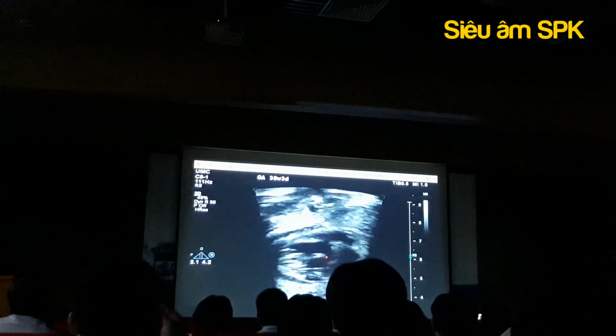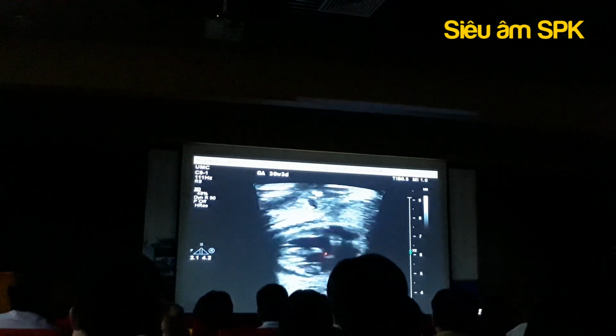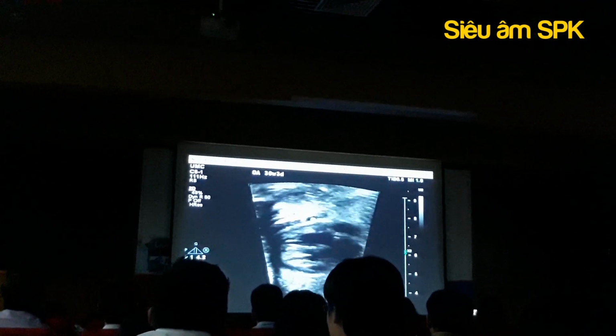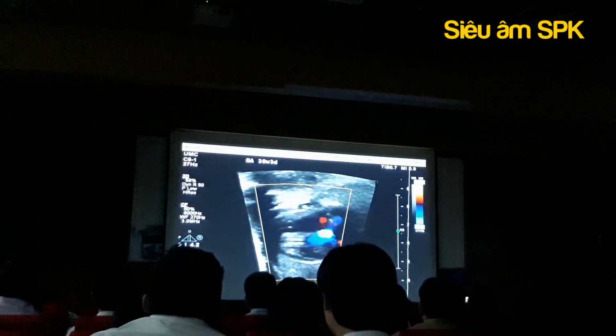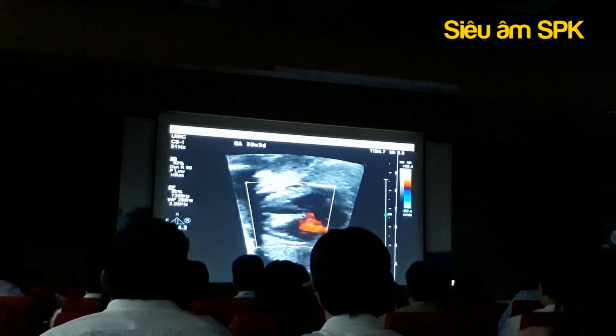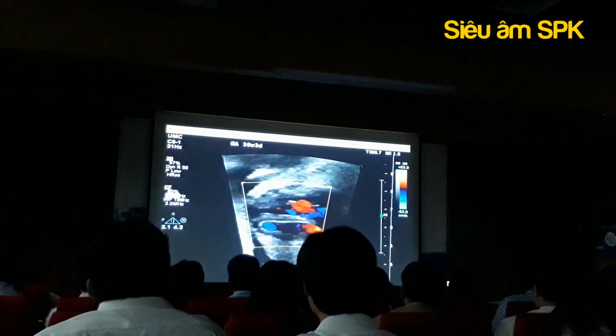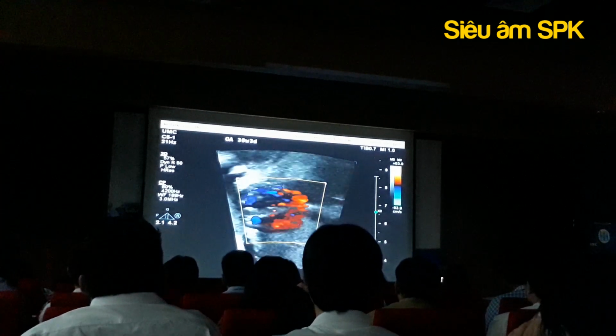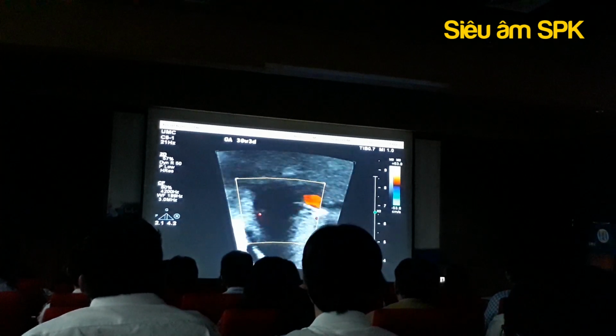Nice picture of the VSD. Bây giờ VSD mình thấy cái thông thương thất mình thấy rất là rõ này. We want to look for additional VSDs. Again, coming down on the scale. Mình coi thử có thêm cái lỗ thông thương thất nào nữa hay không.